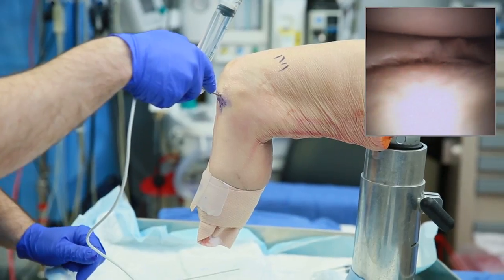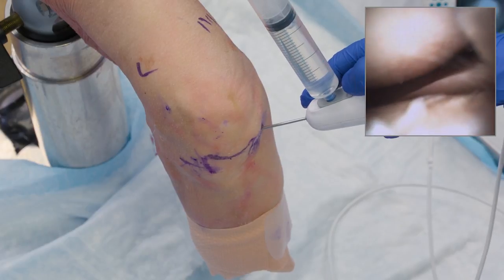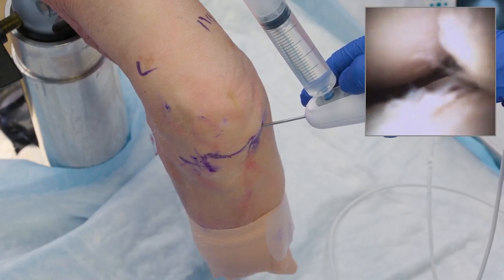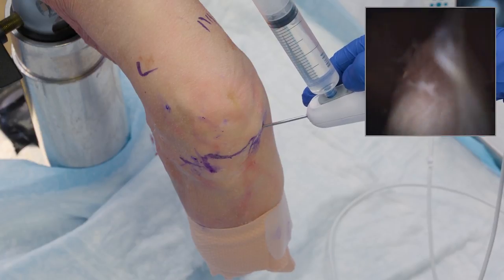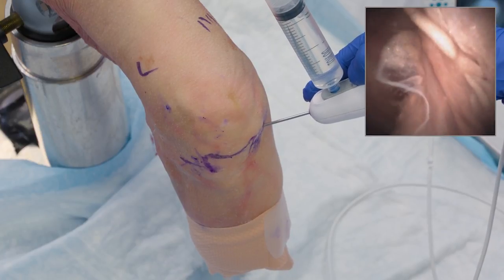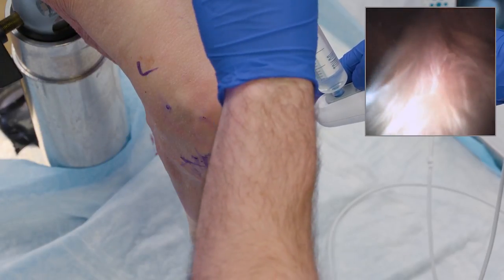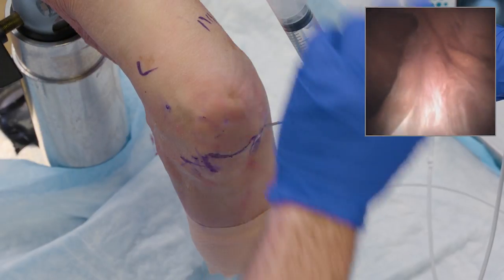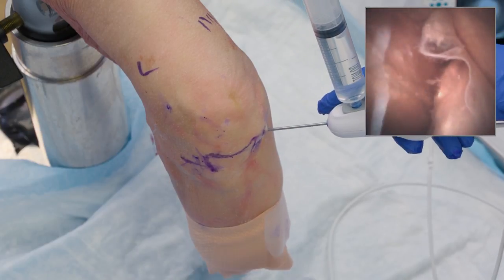The same approach applies going super-medial and entering from the lateral side if that's more comfortable. It's all about triangulating and finding a way to avoid that fat pad. The key in the beginning is to avoid putting too much fluid into the knee joint, but if you need to cheat, go suprapatellar and find a way into the medial or lateral portal without soft tissue impediment. From there you can continue your diagnostic evaluation.